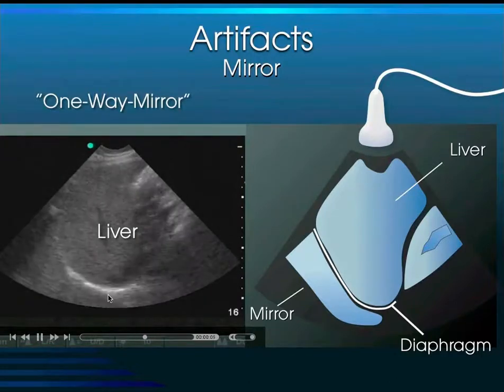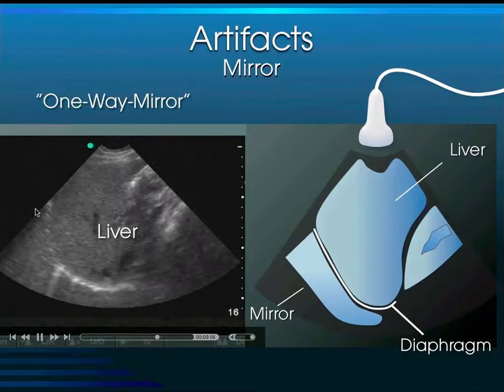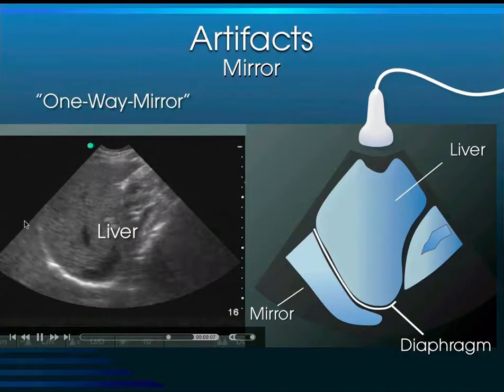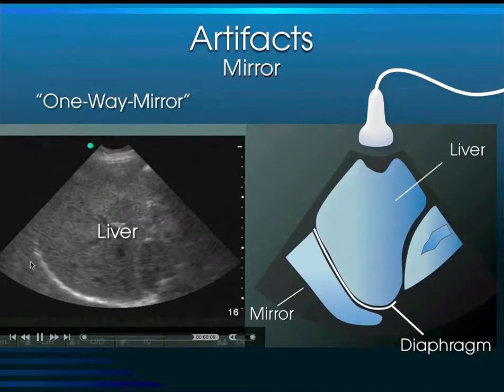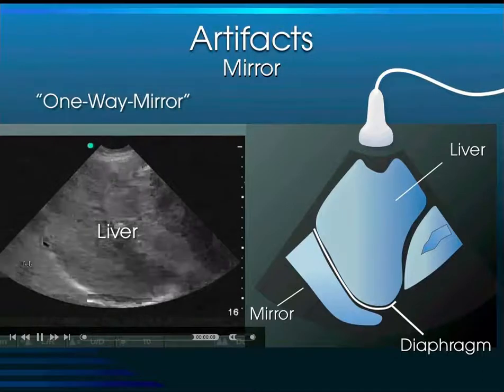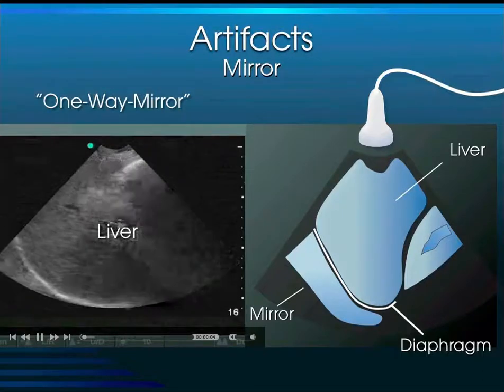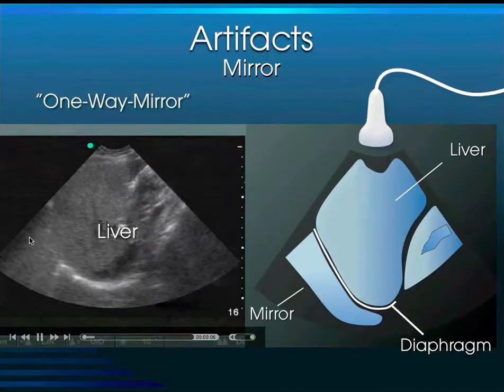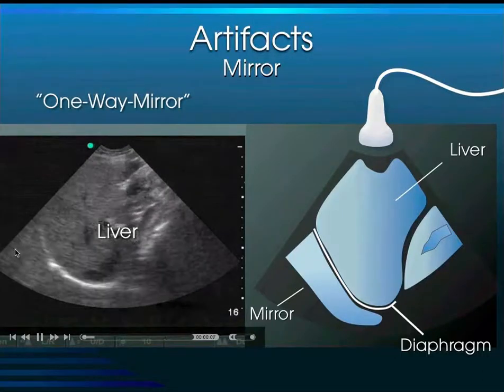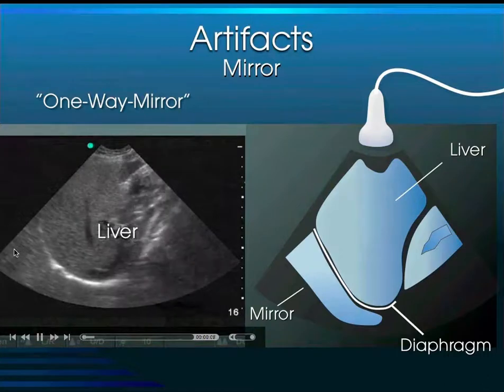The mirror image artifact is expected in all normal individuals. We can see the liver, the diaphragm, and superior to the diaphragm the mirrored image appears. Remember this is a coronal plane, so structures to one side are more towards the head — more superior.